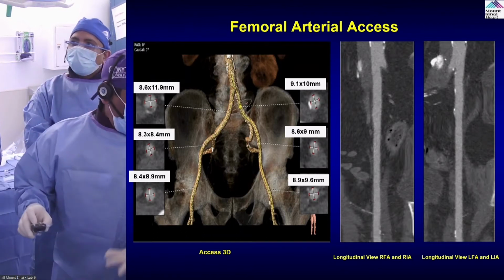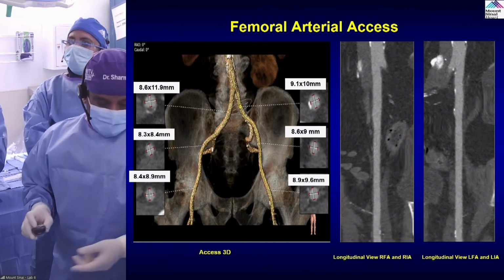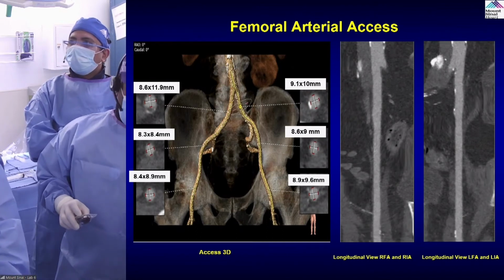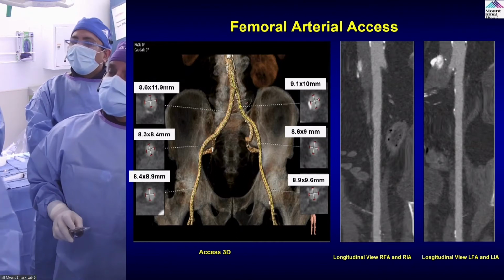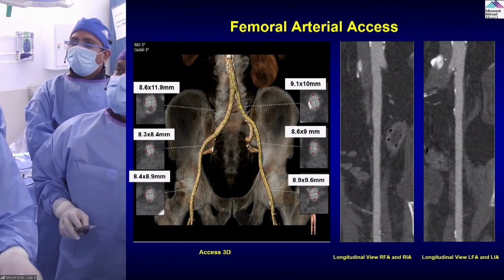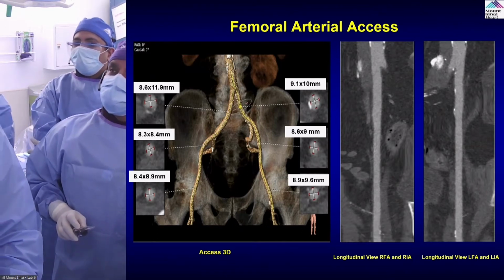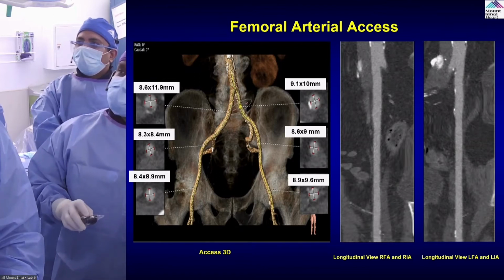And since the patient is on active chemotherapy, we always do an up-and-over bailout. So we got access on the left side, and we have a V18 wire port and the ipsilateral SFA through the left CFA. Also, in high-risk cases, we get an extra vein in case some complication happens, so we can go quickly on the pump. So we have an extra vein in the groin as well.